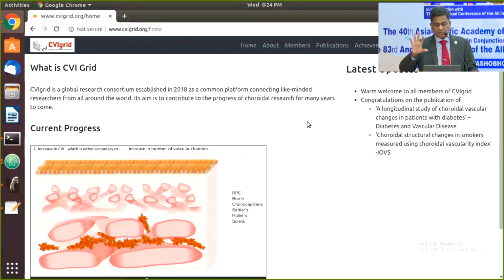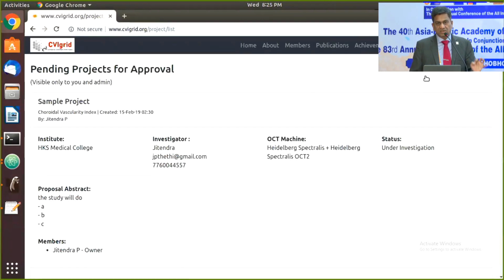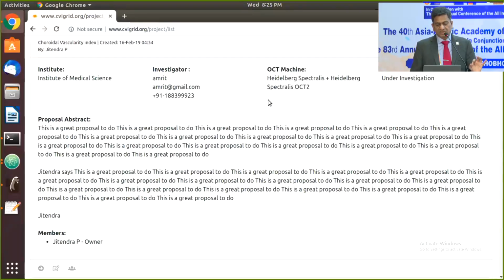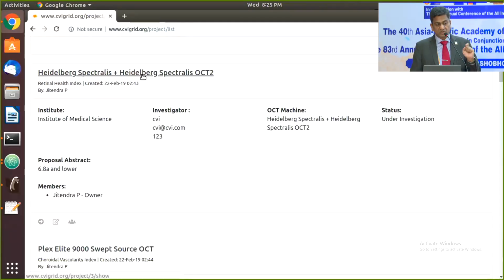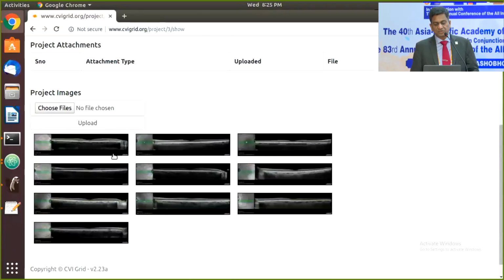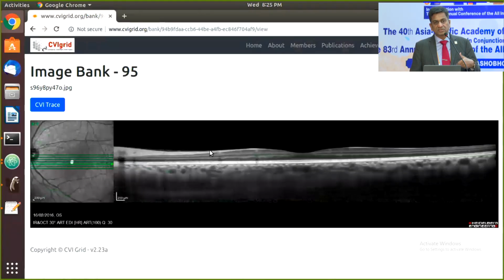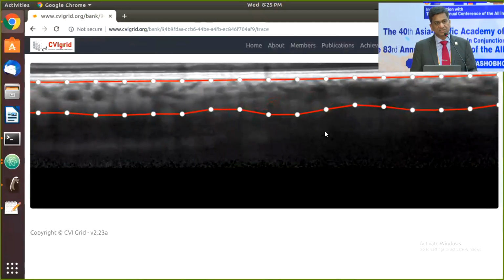Again, it was a portal where you can just go in and upload your image, and we would do some backend work, but the segmentation of the choroidal scleral interface was still done with a bit of a manual attempt because it was still not accurate. Why was it not accurate? Because the interface itself cannot be seen clearly by human eyes, and it was very difficult for the machine also to identify where it is, and we had a lot of errors. So if you put in the image and you think it's automated, no, you still have to correct a lot, and that takes a lot of time. Per image it was taking up to 3 to 4 minutes, and that's not what you want. So we moved on to another protocol.